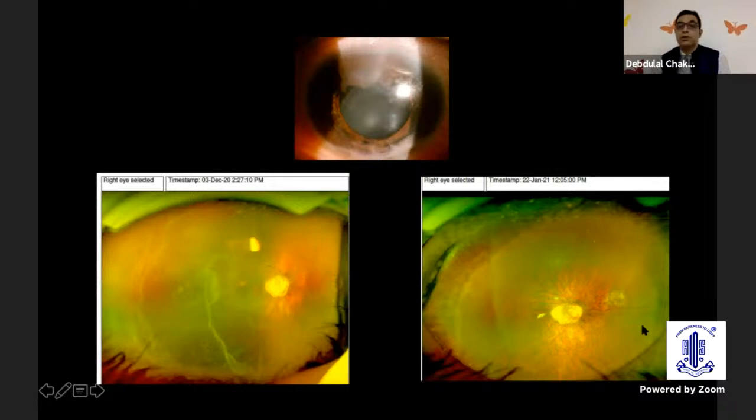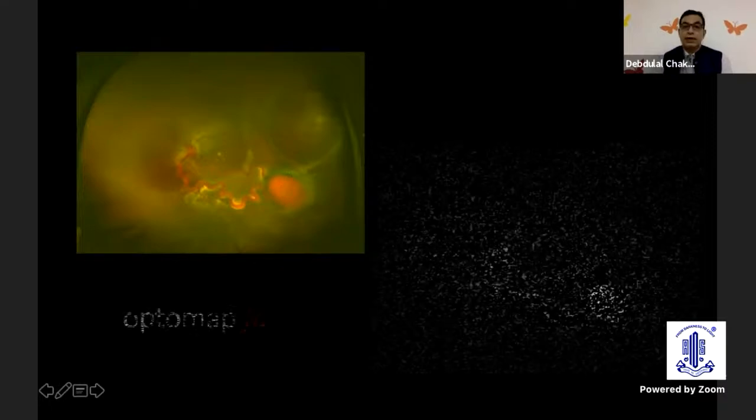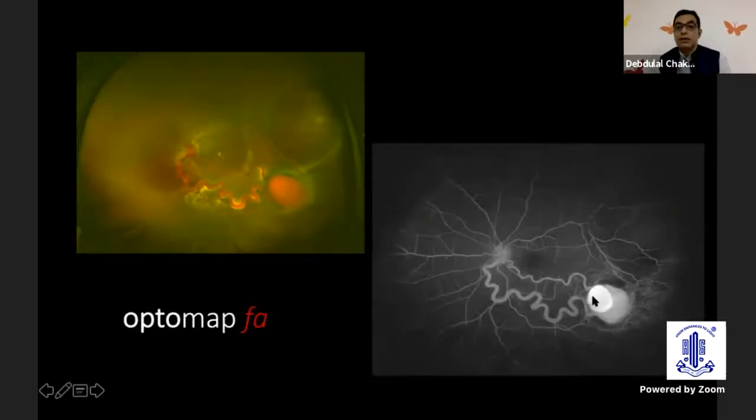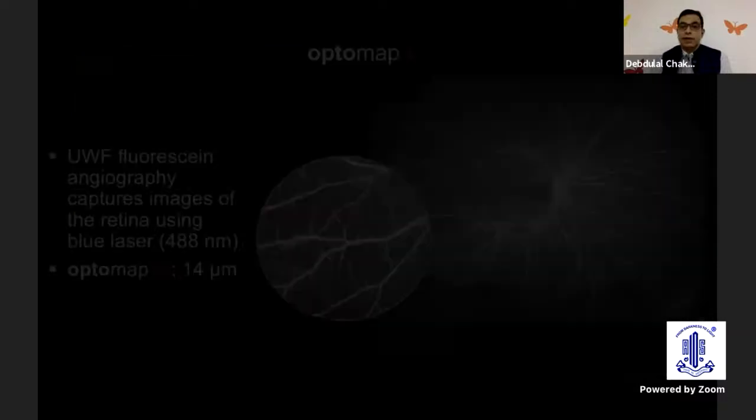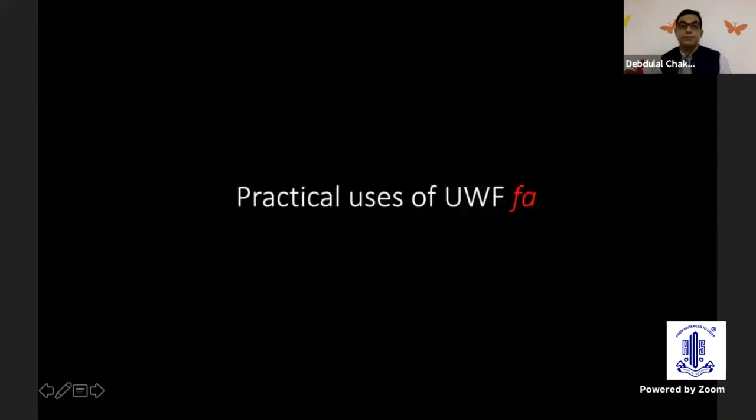And this is, of course, post-surgery when the cataract was taken care of. So the image is much, much better here. You can image peripheral retina, you can image peripheral lesions, and with the Optos FA, this becomes even better, and you can know the complete extent of the disease, and of course the feeder vessels are made visible, and you can plan your treatment. The Optomap FA, or the Optos FA, actually has a resolution of 14 microns, and you can magnify any area of interest to find out what's going on.